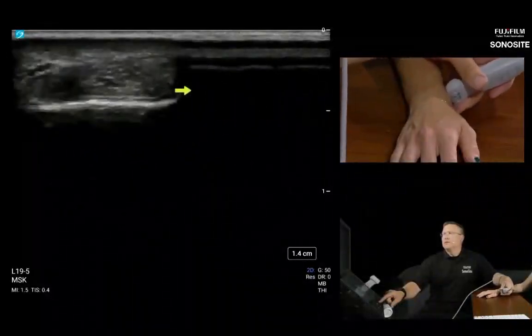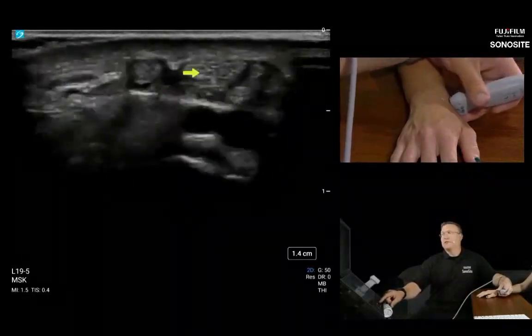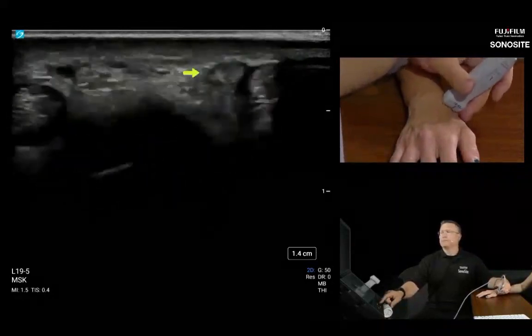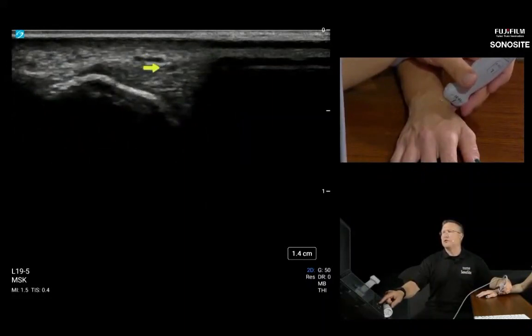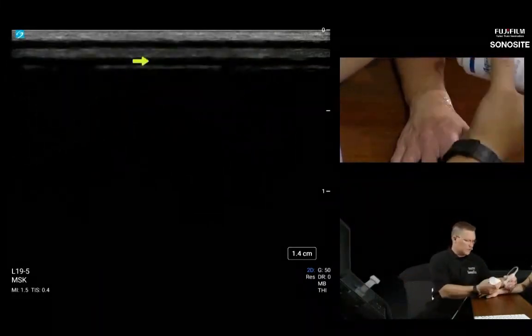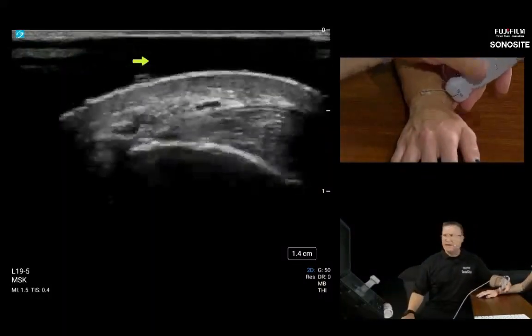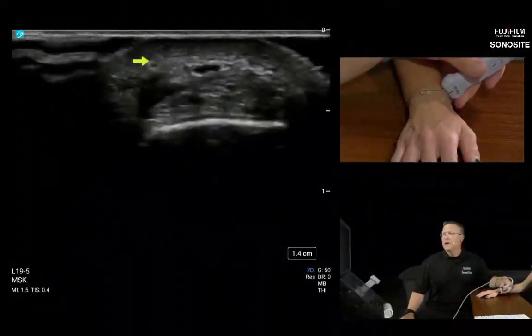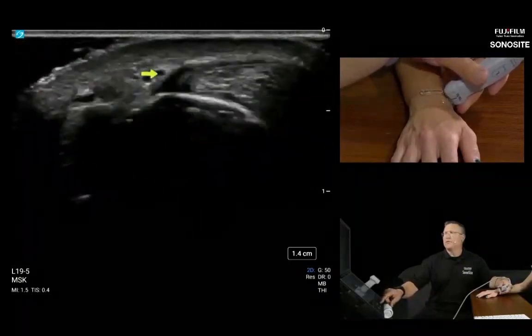Distal to those retinaculum, I'm looking for a few things really. I'm looking for either de Quervain's tenosynovitis, which is very painful, or any pathology in the area of this little superficial radial nerve. So we have a radial nerve here. Going to add some gel, because the little cephalic veins in these areas help us identify where these nerves begin and end. What I can see here is one of the superficial branches of the radial nerve.